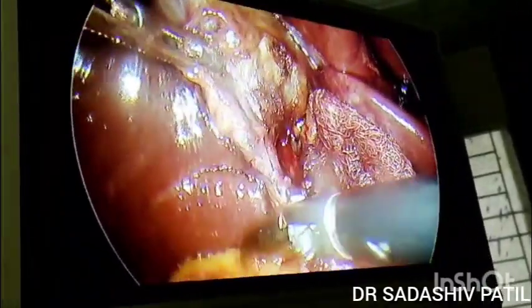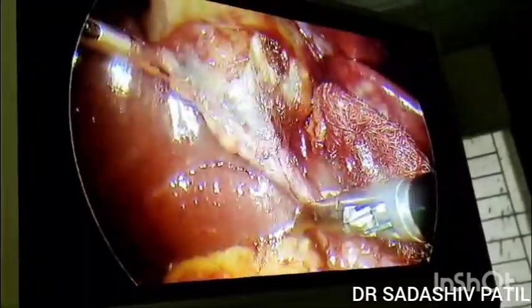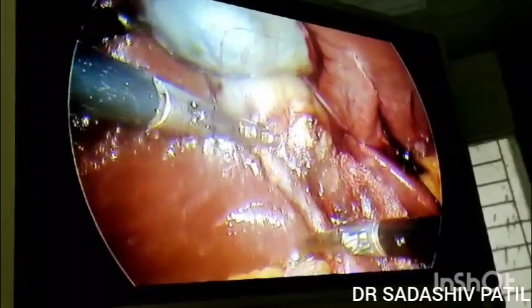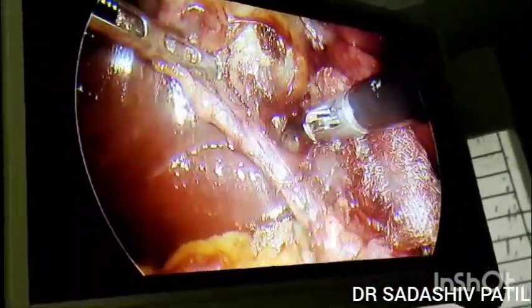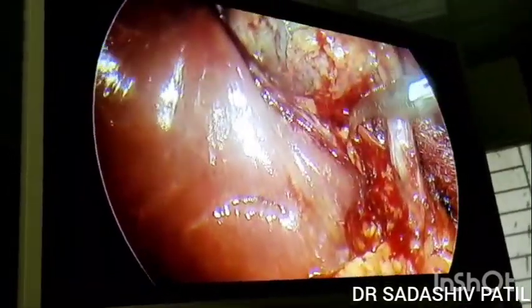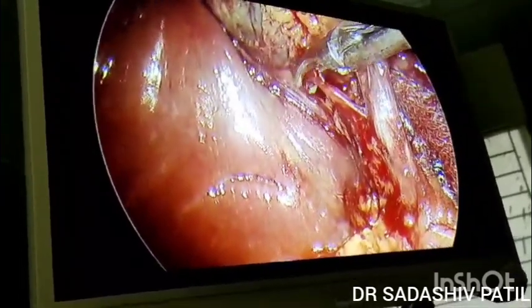Under general anesthesia, 10 subumbilical port was introduced by open method. 10 epigastric port was introduced midway between the umbilicus and the xiphisternum. Two 5 ports were introduced, one in the midclavicular line and another one in the anterior axillary line below the costal margin.